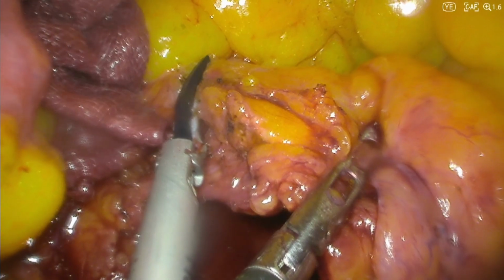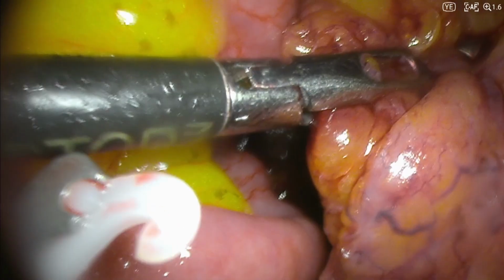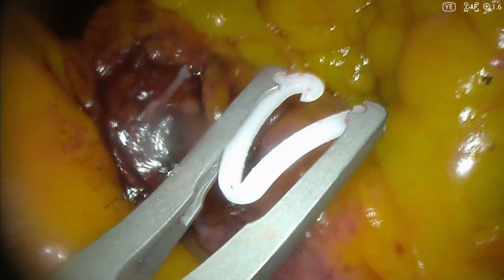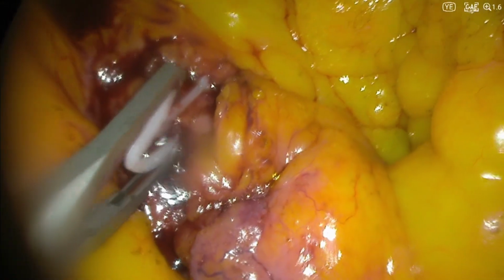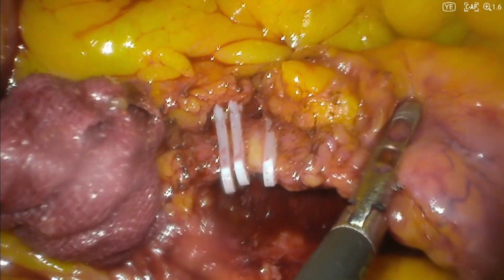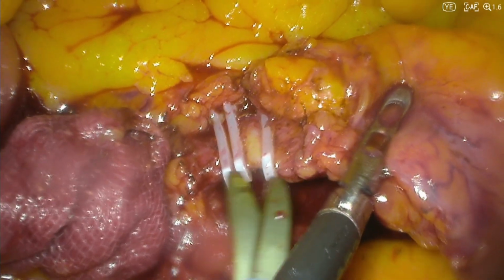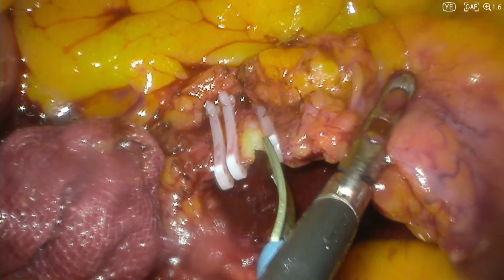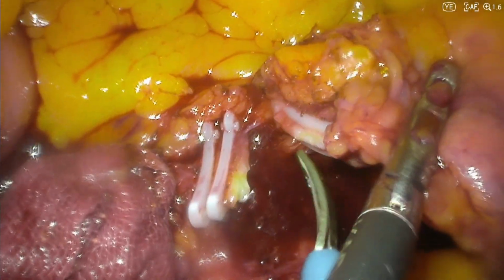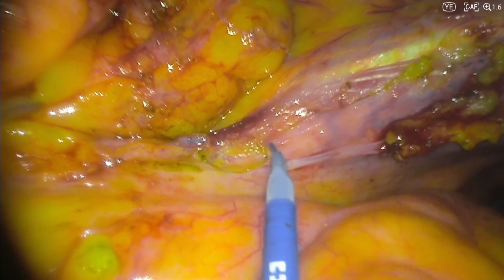An extension of this usage of yellow enhancement can be for the identification of aberrant blood vessels intraoperatively, which further minimizes unnecessary bleeding. Aberrant vasculature concerns have previously come in the way of safe laparoscopic resections in patients with intestinal malrotation. We see the benefit of yellow enhancement in identifying these vessels and making these resections safer for patients with intestinal malrotations and aberrant blood vessels. Finally, here is a short demonstration of the contrast between the small mesenteric vessels against the adipose tissue with and without the enhancement. Now on to the identification of structures to be spared, such as the nerves and ureters.